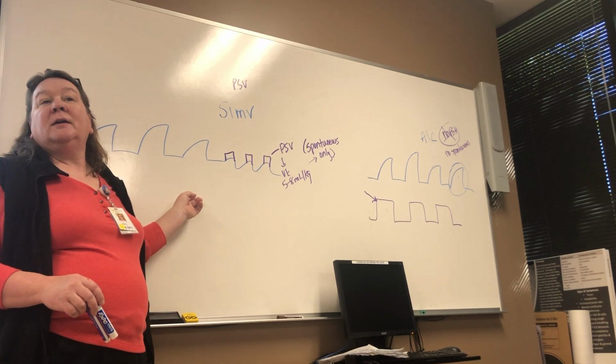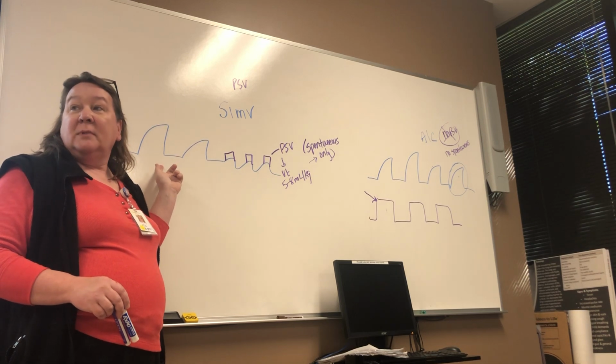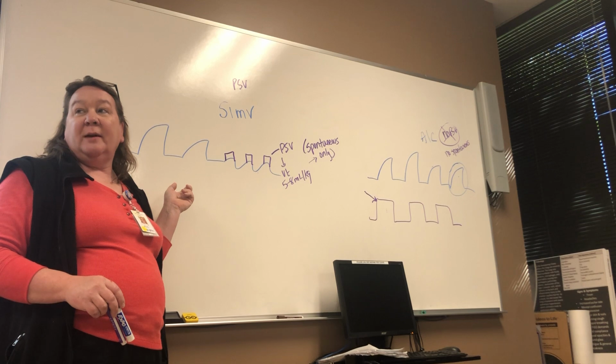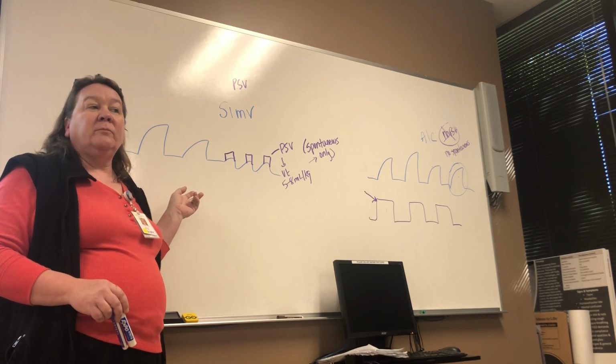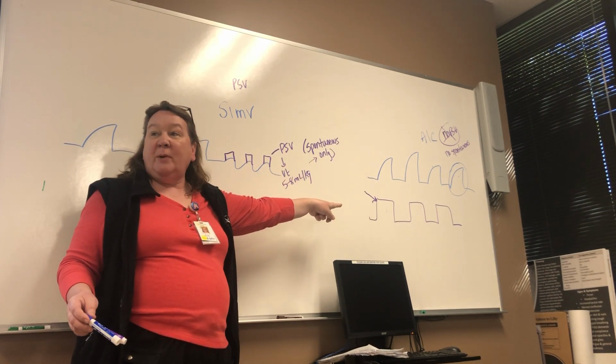What, Haley? You get a set volume? Yeah. The mandatory breath is going to be a set volume. If I'm in pressure control, AC, what kind of breath is the mandatory breath? ACPC. It's a pressure breath. So instead of getting a set volume, you're getting a set pressure.